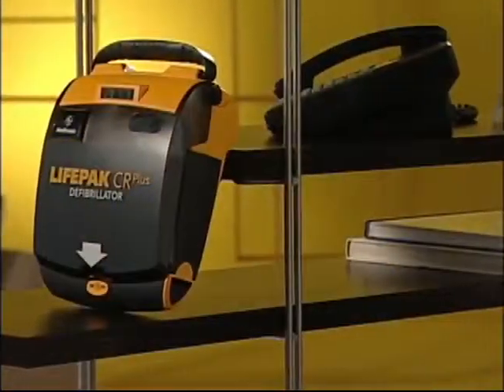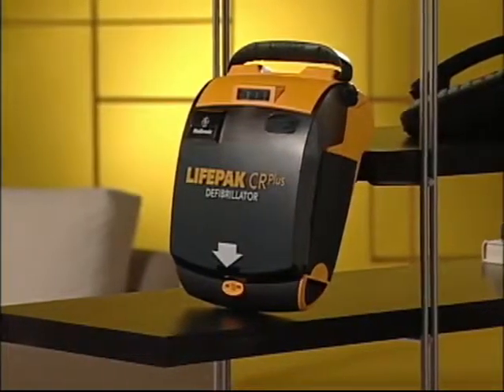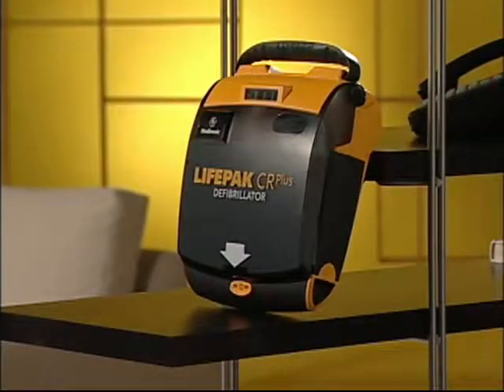And finally, where to store the Lifepak AED. You should keep it in a central location, preferably near a phone so you can call 911 while you're getting the AED. Put it someplace where it's easy to see and easy to grab in an emergency. Make sure everyone knows where it is, and if you take it out, be sure to put it back in the same place. So there you are.